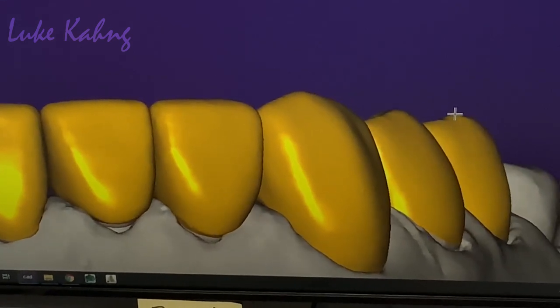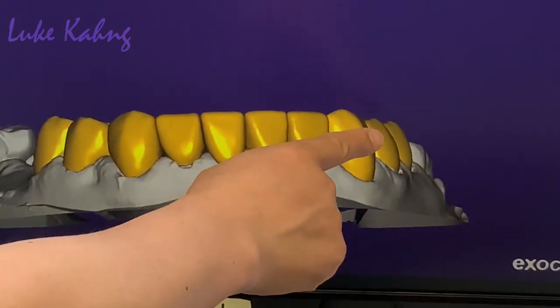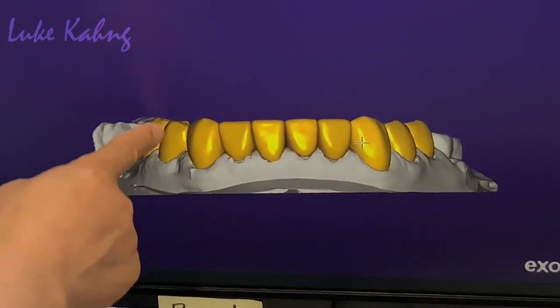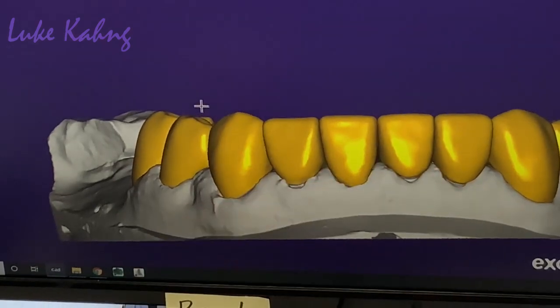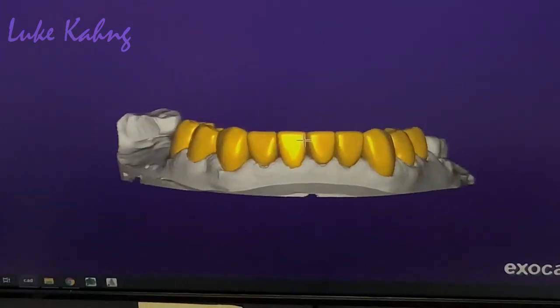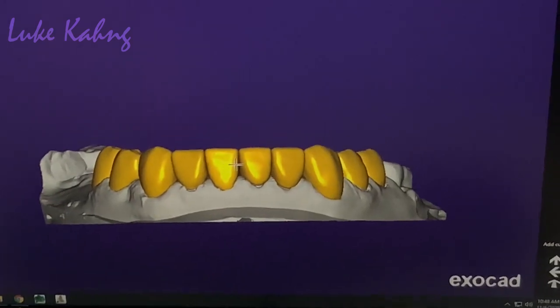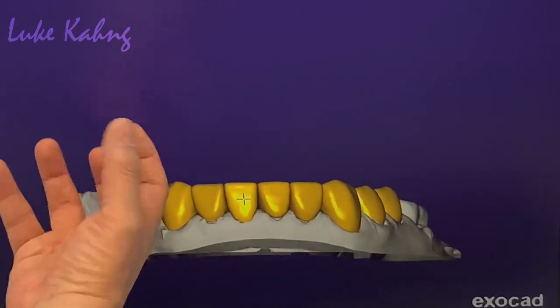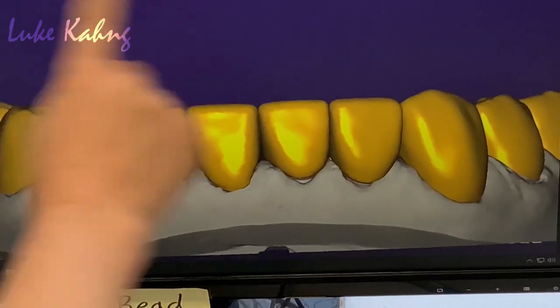Yes. Okay, now the curve of Spee. Okay, now. Good. So when you see this, it's too low. When you measure it, this is too low, make it higher. Just like that. Do you have any exocad tool for this? Not really. Really? No, even though we have the top of the line? The new ones have like a grid in the background. No, big magnify. Yep. Big magnify.